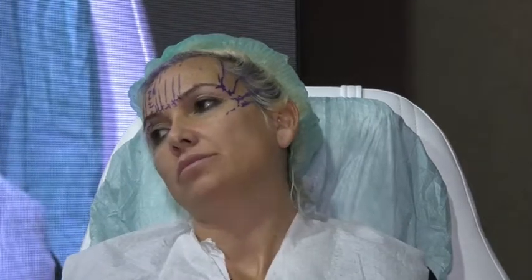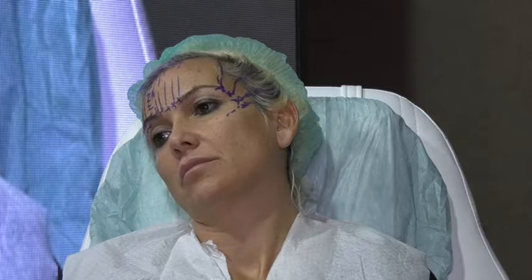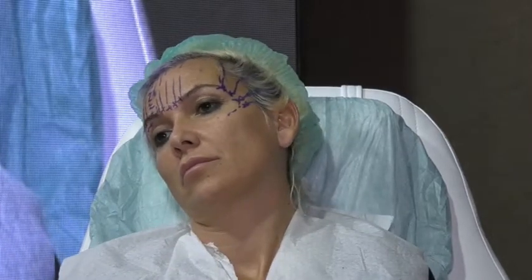How do I put these 3 threads? As we agreed, I'm going to start from down to up. Why? Because this enables me to go up and fix the threads in the temporal tissue. So the threads will be strong, anchored and fixed. When I pull it out, I cannot pull it out. It will stay longer, and they have even an immediate good result, a very strong immediate result. So this is the main purpose.